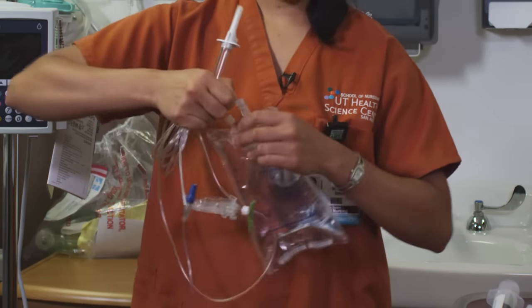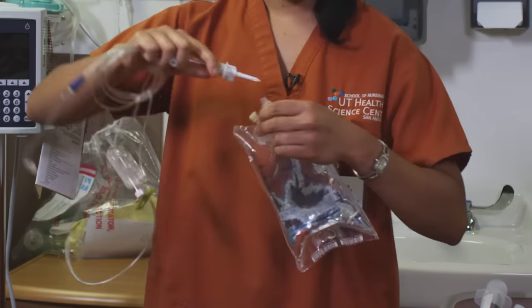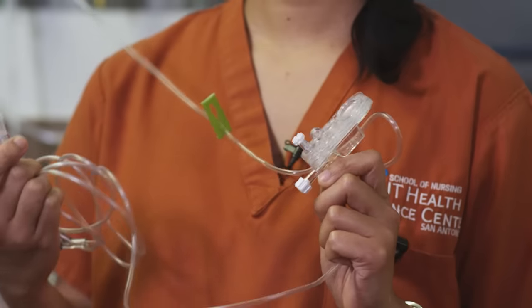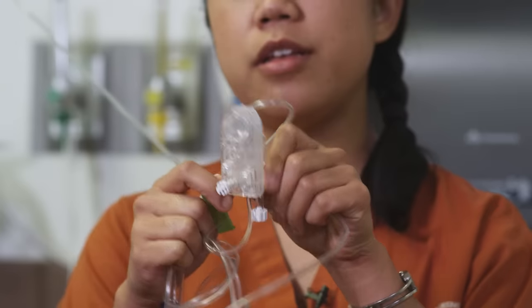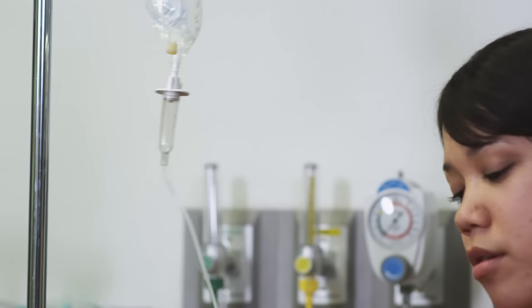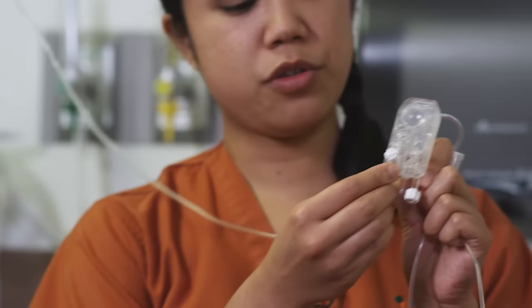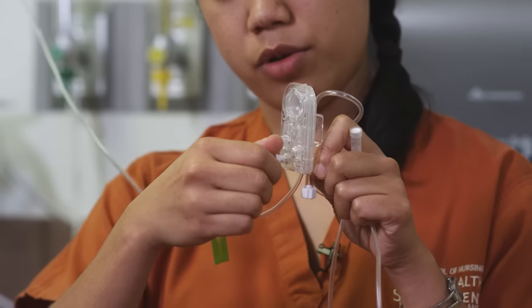Alright, so we're ready to prime. Make sure to keep everything sterile. Before you start priming your tubing, you want to make sure that you're holding your cassette — this one — so that your dome chamber is on top. Go ahead and squeeze, or unclamp here. This is your screw here and it serves like your roller clamp; it regulates the flow of your fluid into the tubing. Go ahead and turn that.